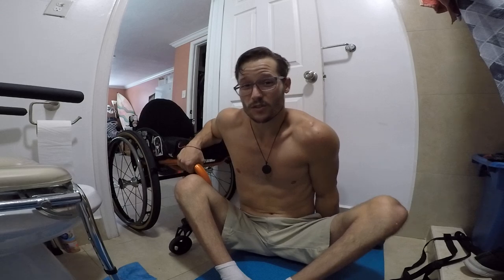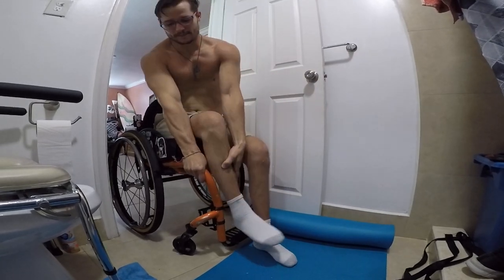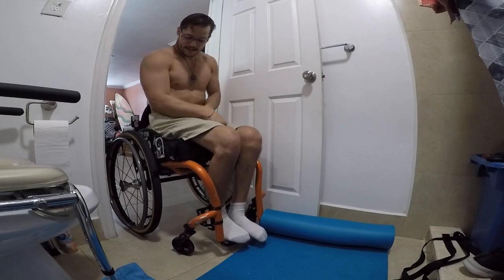My other hand goes right under one of my butt cheeks — I don't want to put it too far, I want it as close as I can to the wheelchair, right under my butt cheek. And then you just go up. And that was actually a really good one.